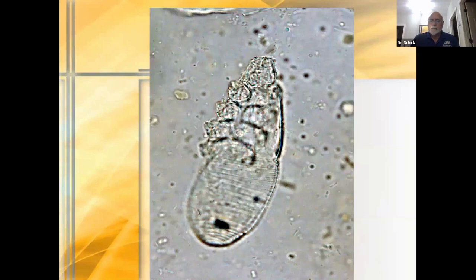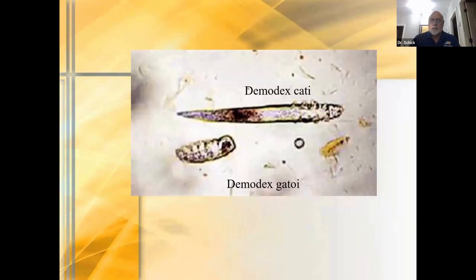Look at the short, stubby body of Demodex gatoi, but still with four fully developed leg pairs. In comparison, look how much smaller it is compared to Demodex cati. When you look at Demodex cati, you can see how much longer the tail is versus a Demodex canis mite.